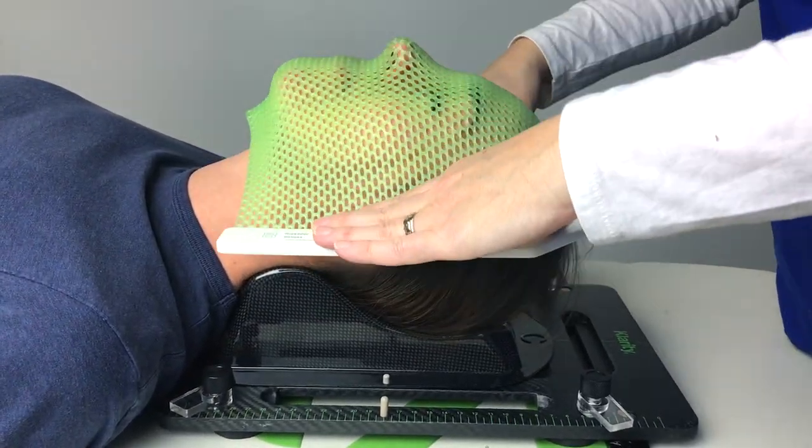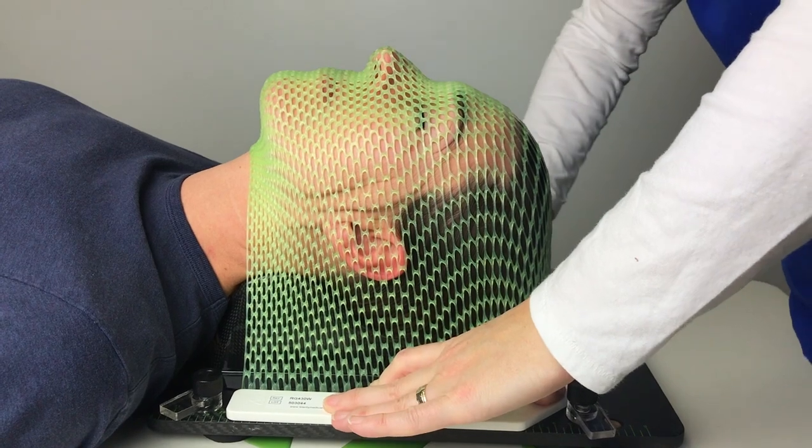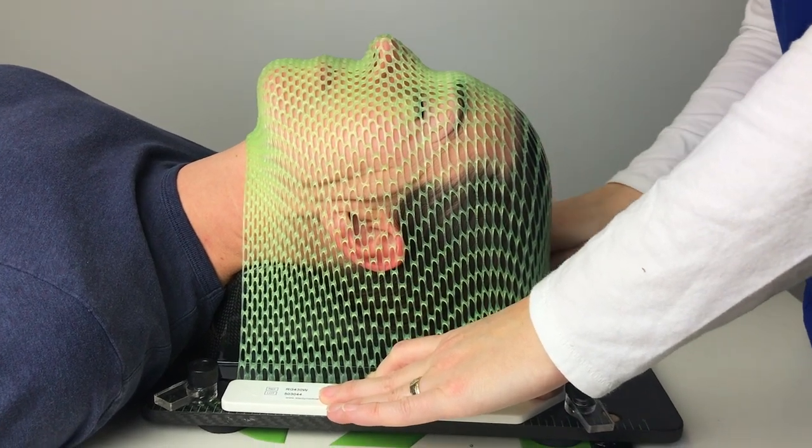Once the mask is ready to be molded, align the mask over the face and pull straight down to ensure an even pull.